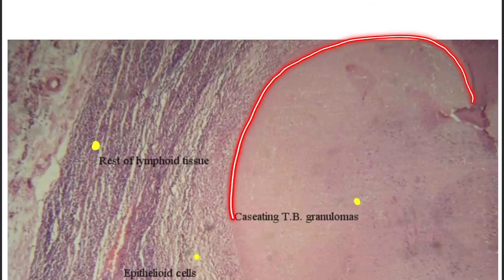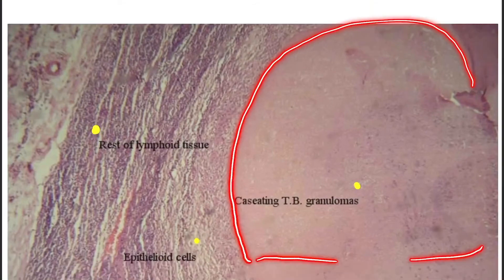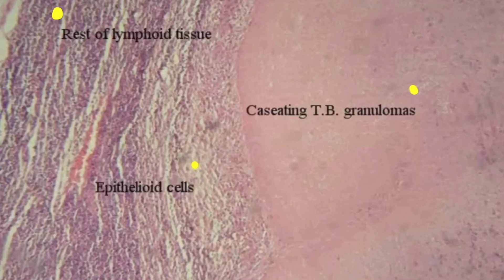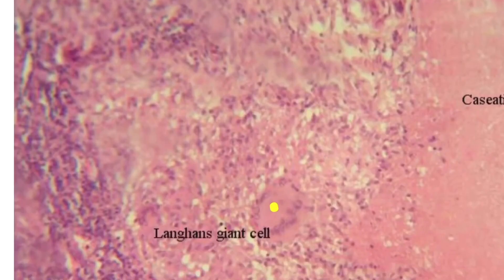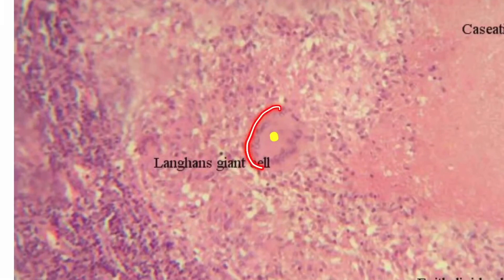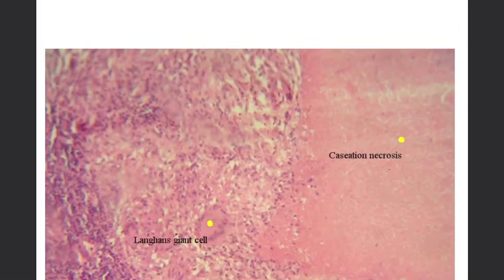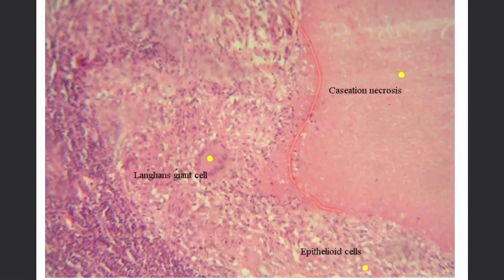Let's see in the histopathological slide. Here, the normal granuloma has become the caseating tuberculosis granuloma. Here are the epithelioid cells present. The Langhans giant cell is also present — multiple epithelioid cells fuse to form it. Here are the nucleus and another area of caseous necrosis which causes the caseating granuloma.